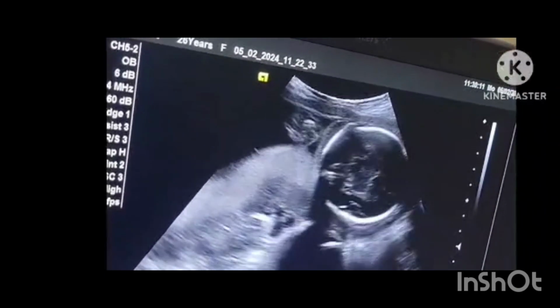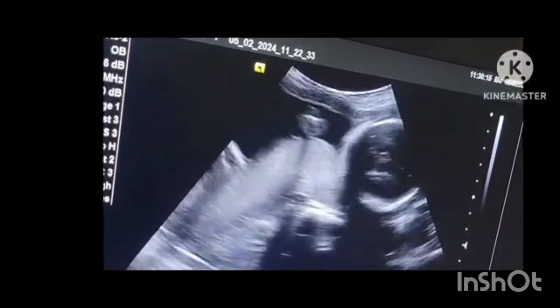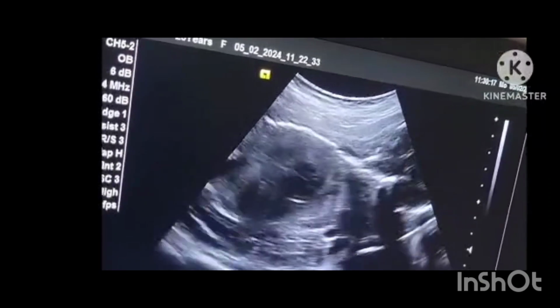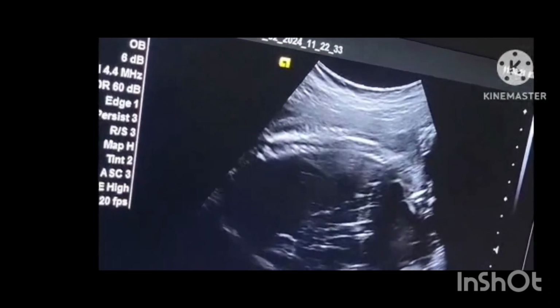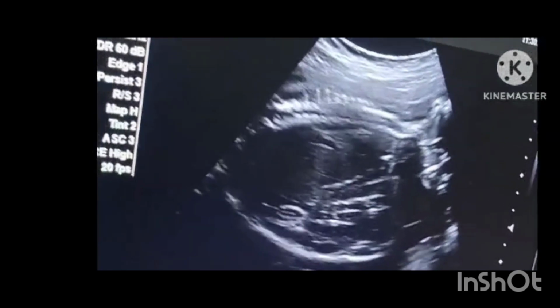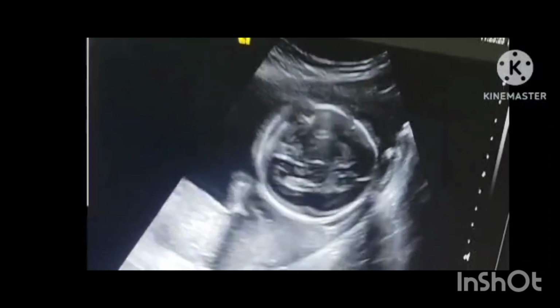Performing the scan, as shown, reveals a gravid uterus with a viable monofetal intrauterine gestation. The biparietal diameter, head circumference, abdominal circumference and femur length average a dating of 21 weeks 04 days. A posterior placenta, not touching the cervix, thus excluding previa. This female patient, aged 26 years, says the pain is bearable.